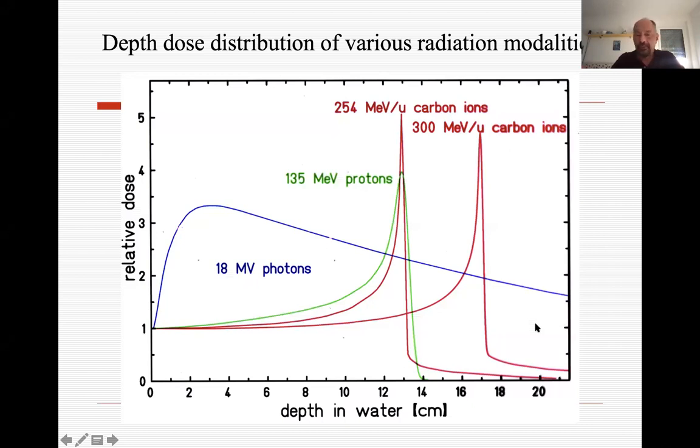They use particle therapy because of the physics, of course. The depth dose distribution, again, this is the depth dose distribution for photons, very high energy photons, 18 megavolt photons that are seldom used for therapy, but they have a much better depth dose profile than low energy X-rays that drop even more quickly. But in any case, this is not comparable to the nice Bragg peaks that you see for protons, which are by far the most used particle for charged particle therapy, or carbon ions.